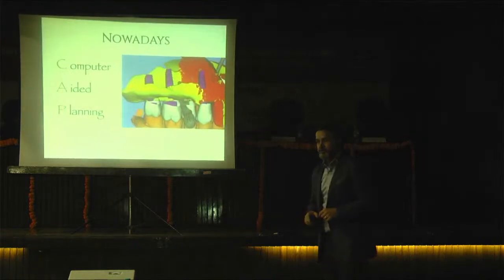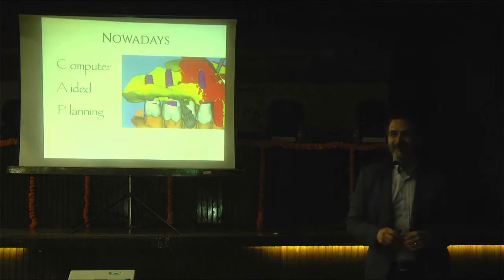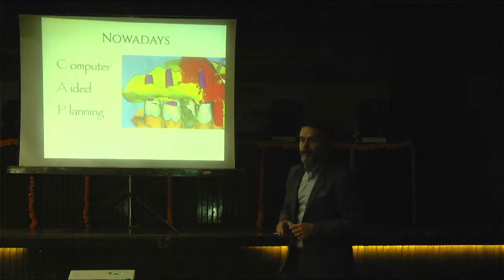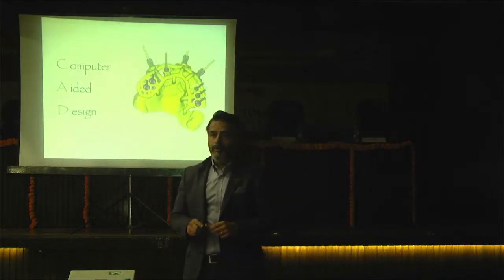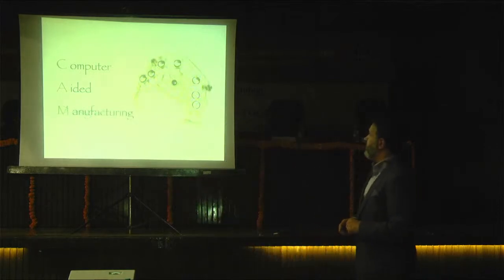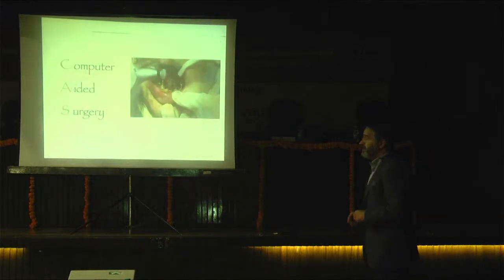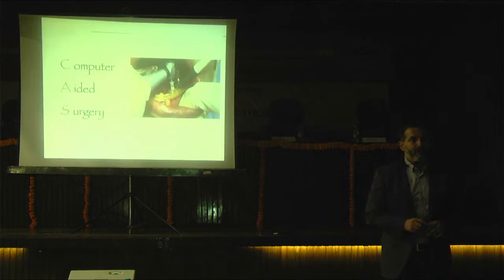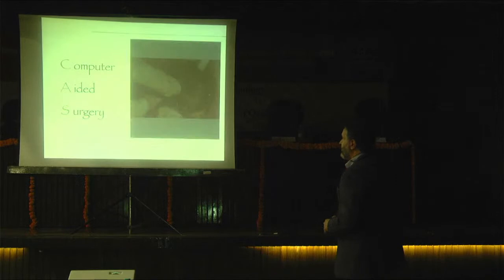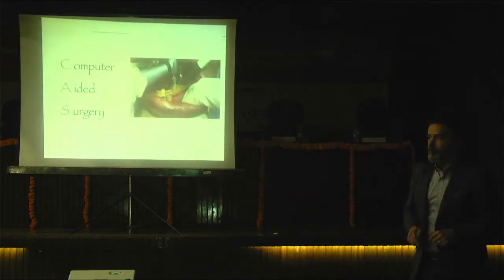So nowadays, we came to the subject. Is there anyone sleeping? No? Okay, that's good. So nowadays, we deal with computer-aided planning. So we do computer-aided design, and we do computer-aided manufacturing, and lastly, we do computer-aided surgery with the surgical guides, with a stopper, with a tube-in-tube system, with a different way of placing the implant, which is a very patient-friendly approach.